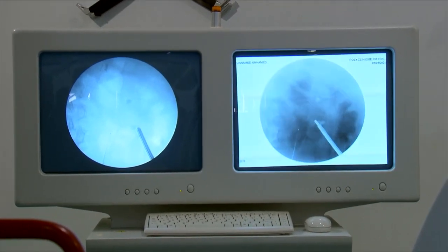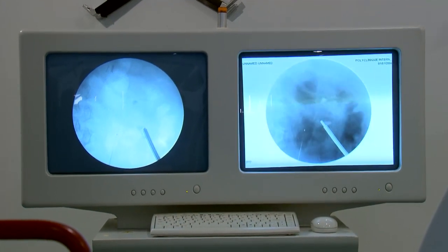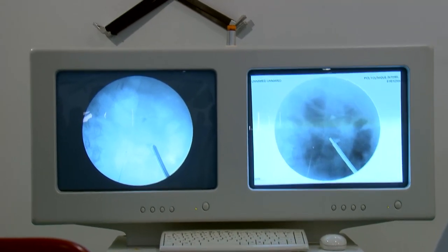Maybe this is the stone. Yes. Is it a blood clot? Just a moment, please. Show us the endoscopic view. Yes, thank you.